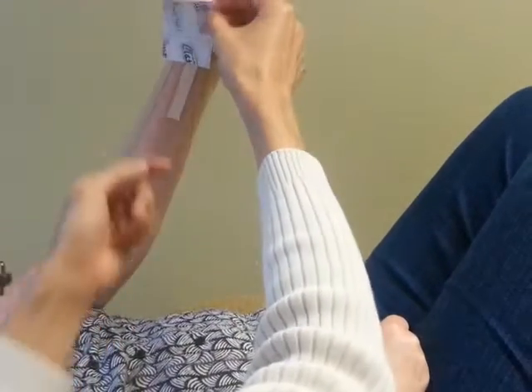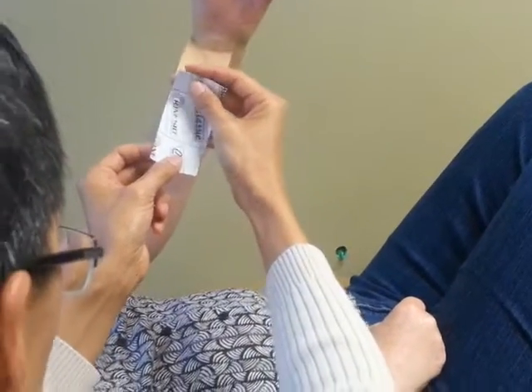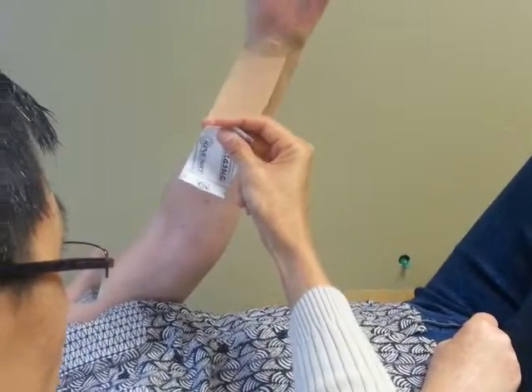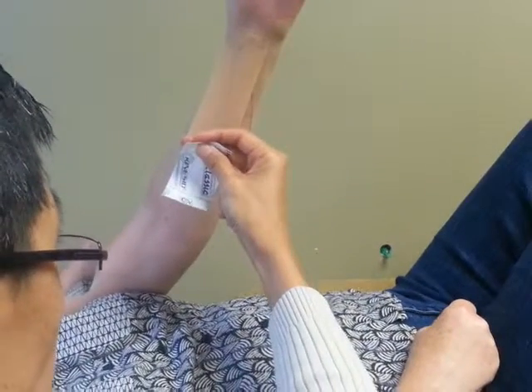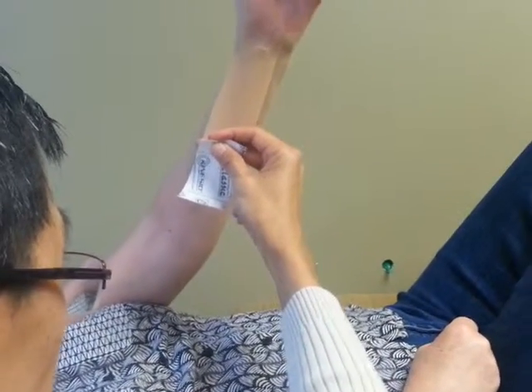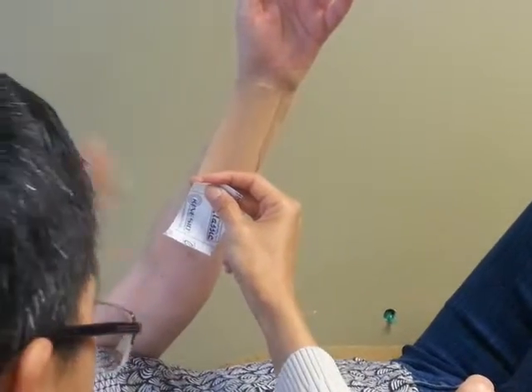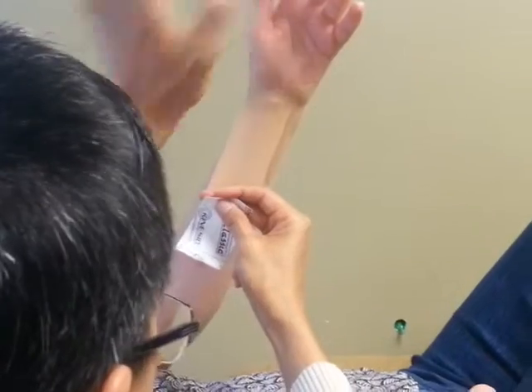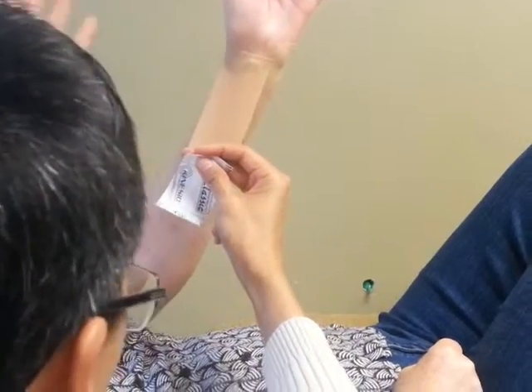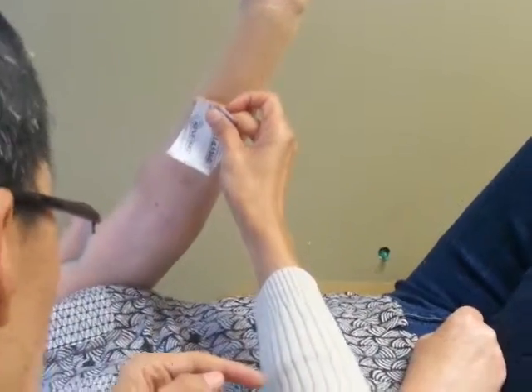I only use this brand — this is the original KiniStu tape — because it works the best of the brands I've tried. So now you start peeling off, grab the other end, and stretch it about 30%. This is a full stretch right there — that's 100% stretch, that's 50% stretch, and about 30 to 50 is about right there. You see how it stretches out from here to here. This is really important: you want them to go away from the stretch, so bend their joint away from the stretch, and now you tape it down right here on the skin.